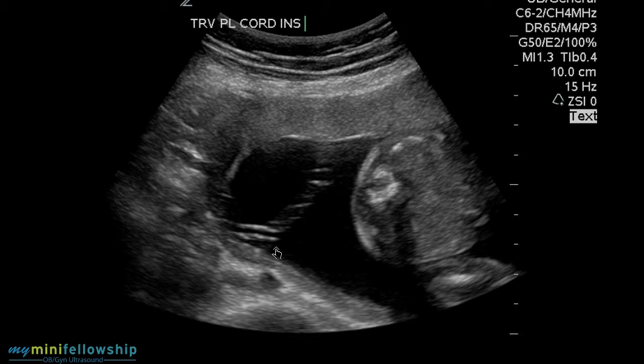Anytime you think you see a vessel near the placenta, near the internal os, any case of succenturiate lobe, and any case of vasoprevia. I'm sorry, not vasoprevia, a Velamentous cord insertion. Those are the times when you must do a color Doppler over the cervix. And by the way, it's not a bad idea to do a color Doppler over the cervix case after case. I have the sonographer do that on every case. I think that's an excellent idea.